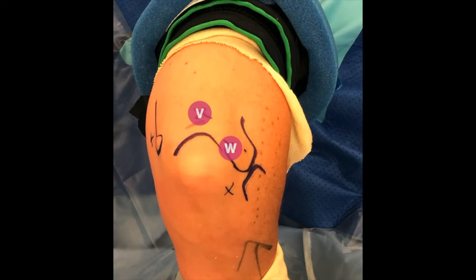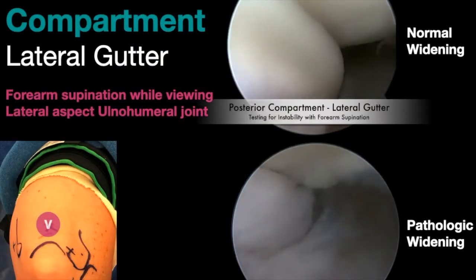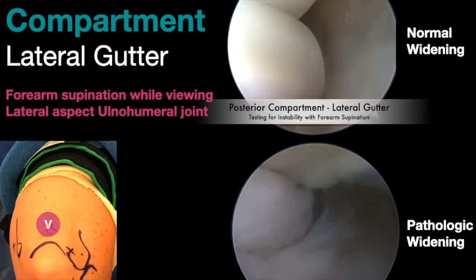We do elbow arthroscopy in the lateral position and typically enter the joint in the posterior compartment. We view from the direct posterior portal and work from the posterolateral portal initially. When viewing the posterolateral compartment and the radiocapitellar joint, we view from the posterolateral portal and make an accessory posterolateral portal for working. So here we are in the posterior compartment, slipping into the lateral gutter, viewing the ulnar humeral joint on the left and the capsule and ligament on the right.